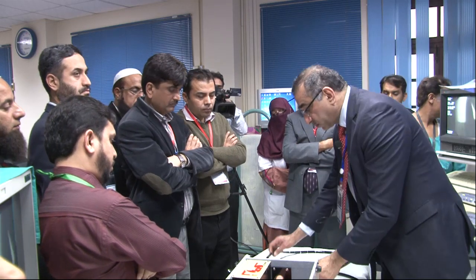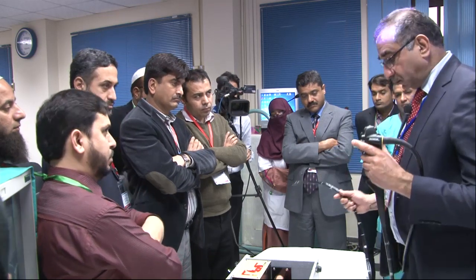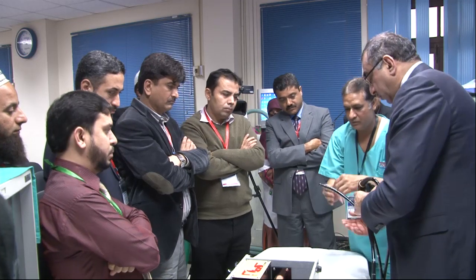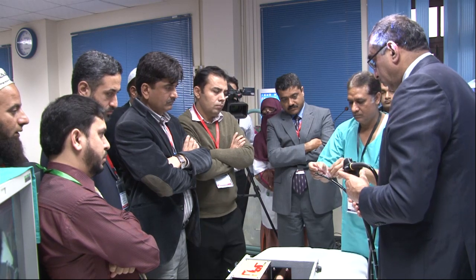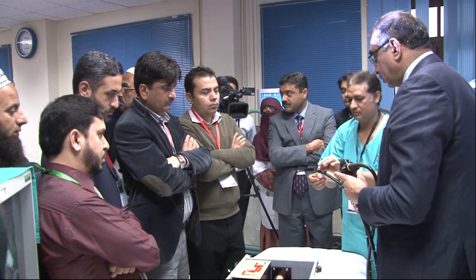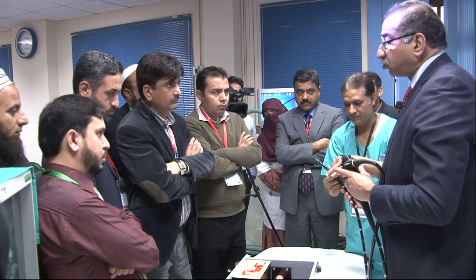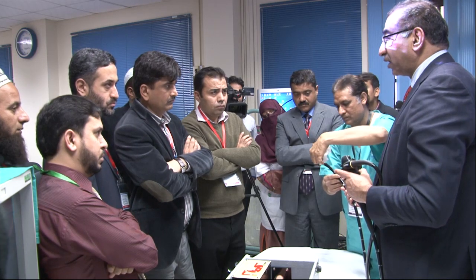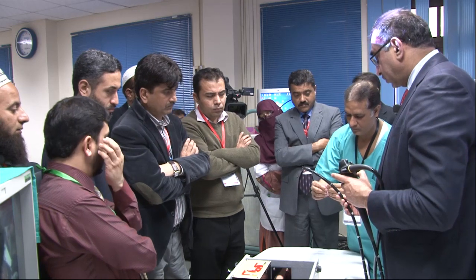So with the scope, apply a bit of lubricant. It's always a bit of a struggle with this one because it's not really fit for purpose, but that's as close as we could get to the real thing, right?